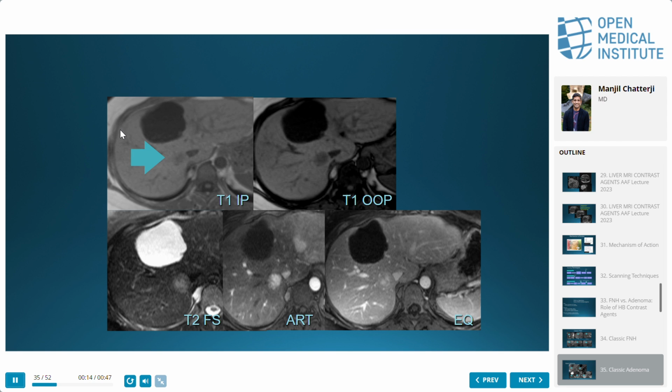Good one, huh? So again, this is a perceptual thing with your eye. Maybe you thought that was the intrahepatic IVC. I always kind of have to do a double take, but this is not that.